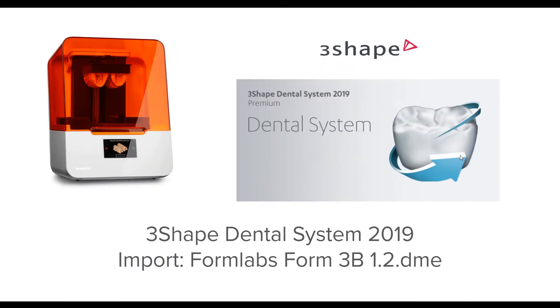Before we get started, a couple quick notes. In this demo I'll be using 3Shape Dental System 2019. Some of the older versions are generally pretty similar, but something really important for removable dies is that in 2019 they enabled the ability to adjust friction of removable dies dependent on the size of the die. You will get better consistency between anterior and posterior dies using 3Shape 2019 or newer. So if you're using 2017 or 2018, consider upgrading if you're having die fitment issues from small to large.